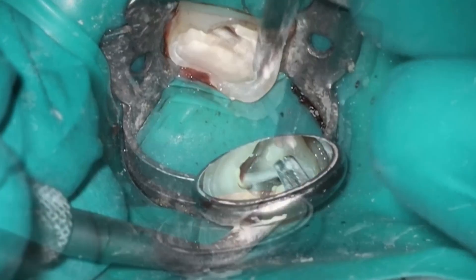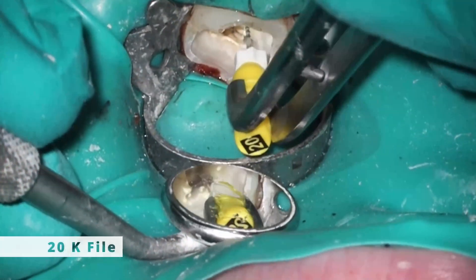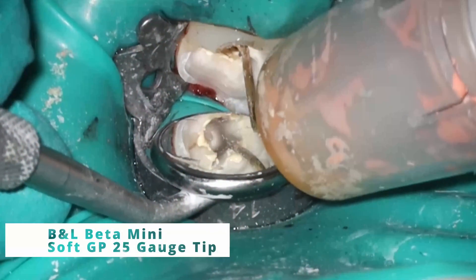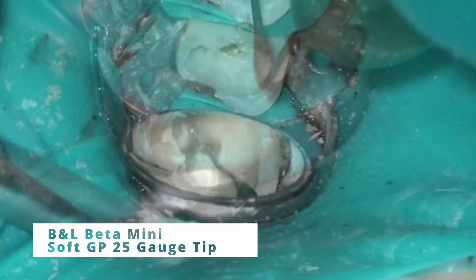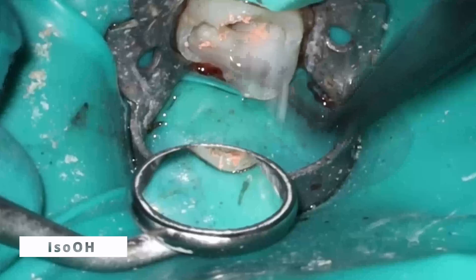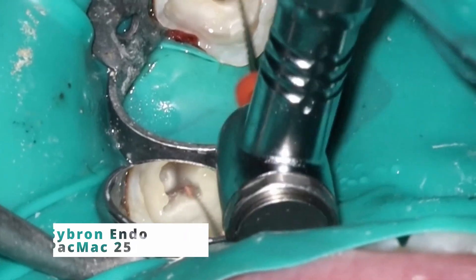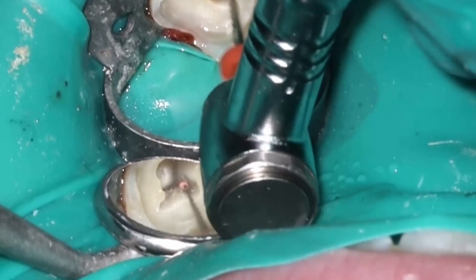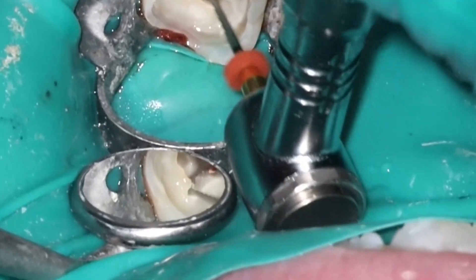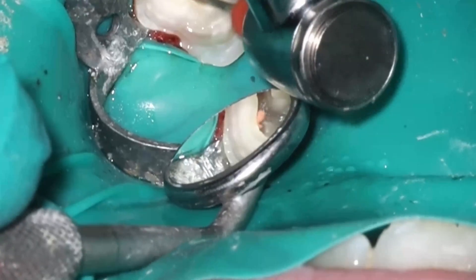If you watch my curved canals video, you'll see that what I do is use a smaller K file to recapitulate. In this case, the 17 went down very easily on all the canals including that Radix. So pretty easy to recapitulate with the 20 K file here. I sped up all the squirt technique footage — you've seen that before, and I have a very recent video where I go into depth a little bit more on how the actual squirt technique works.